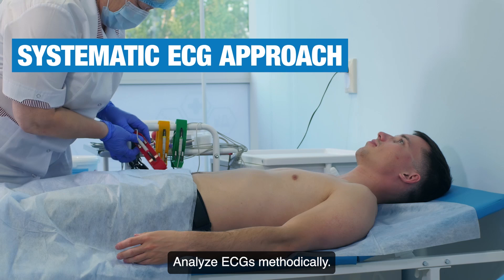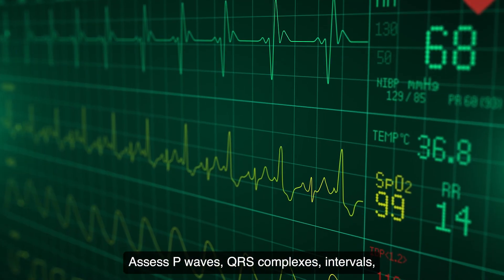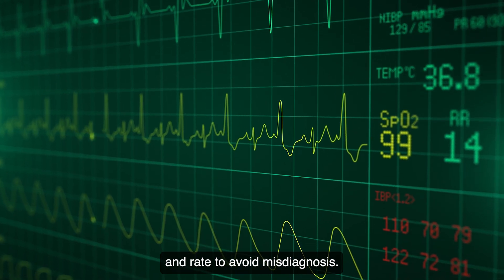Analyze ECGs methodically. Assess P waves, QRS complexes, intervals, and rate to avoid misdiagnosis.